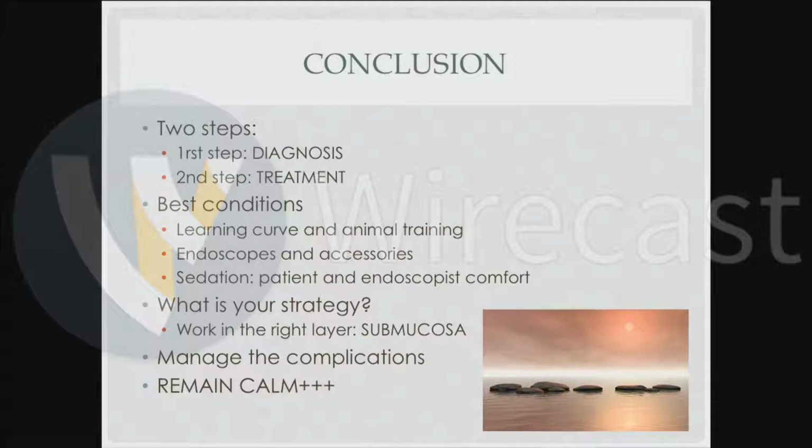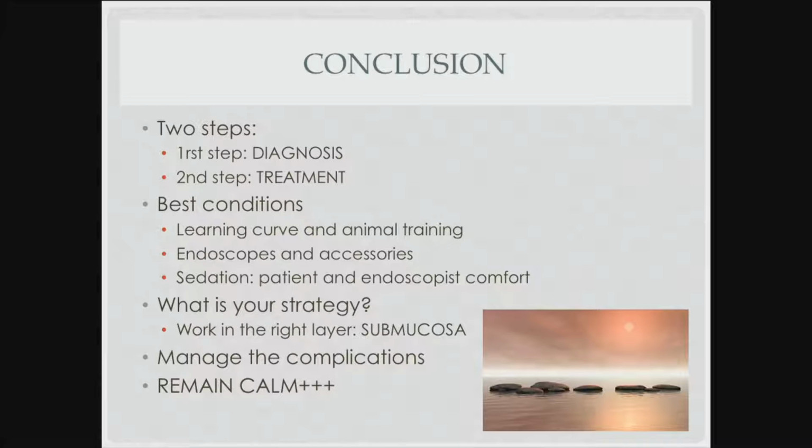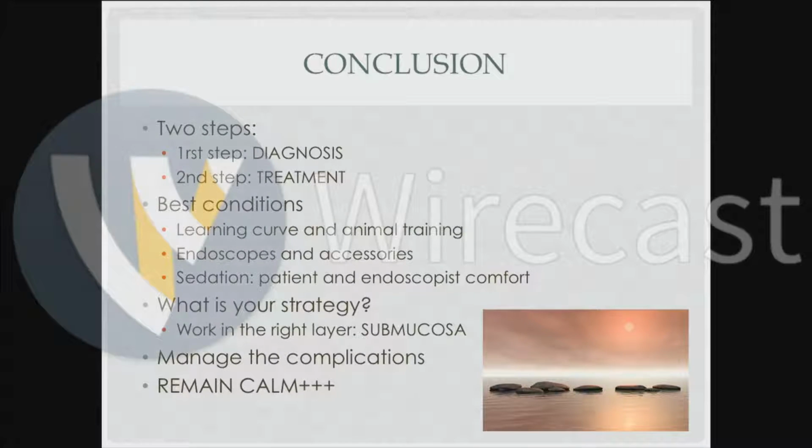Gabriel, you mentioned the role of US. In your presentation, you showed around 80% in sensitivity and also specificity. So it means that we have at least 20% of under or overestimation. So you think US is mandatory for ESD in all cases or only in selected cases?